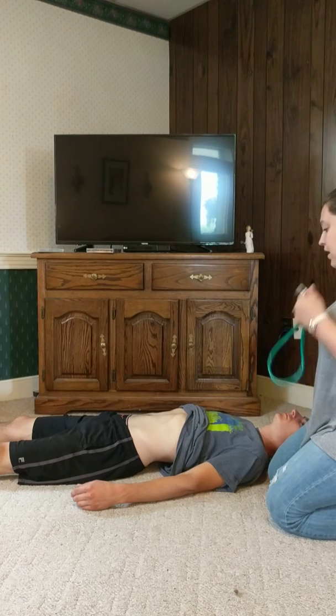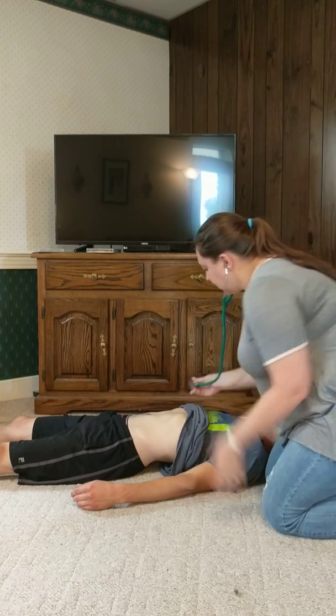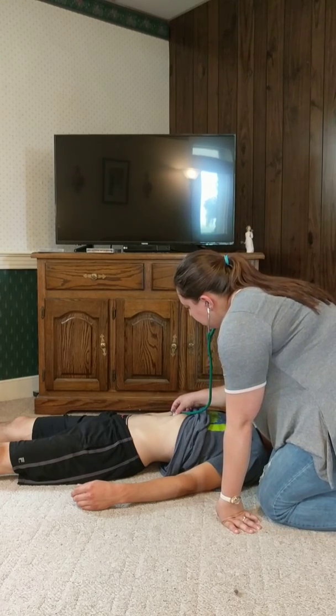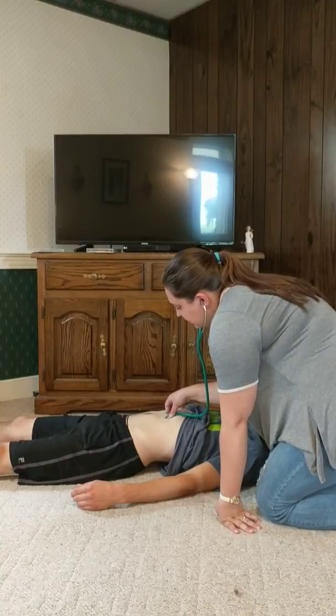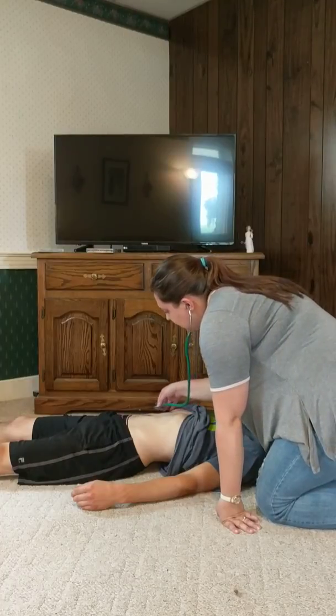Next, we're going to listen for the aortic artery. That is not heard, and then we'll move on to the renal arteries. And listen bilaterally, along with the iliac arteries.